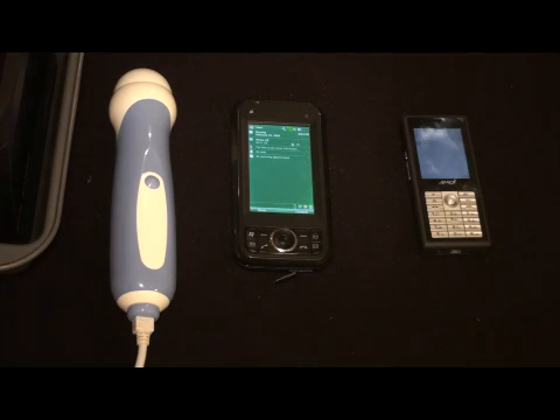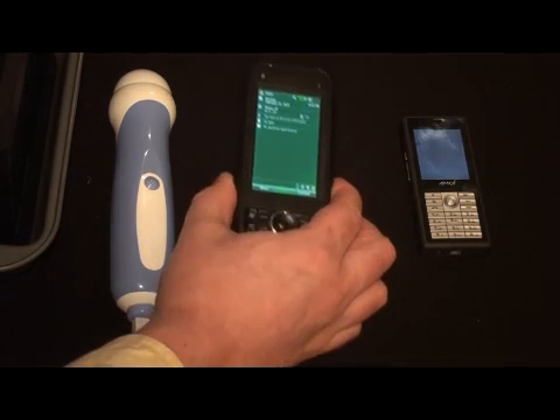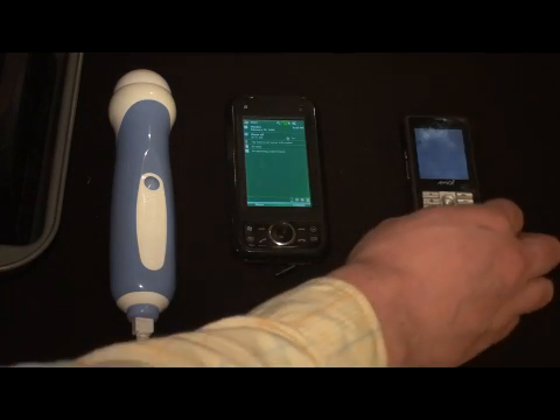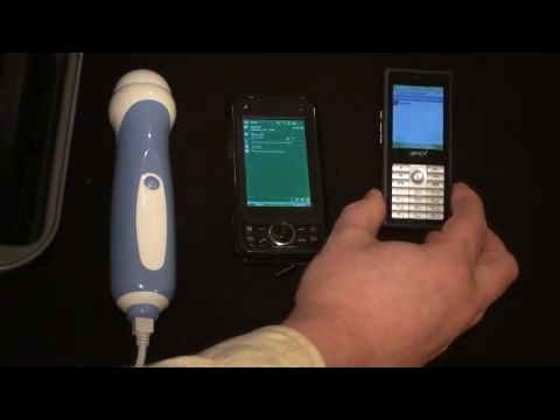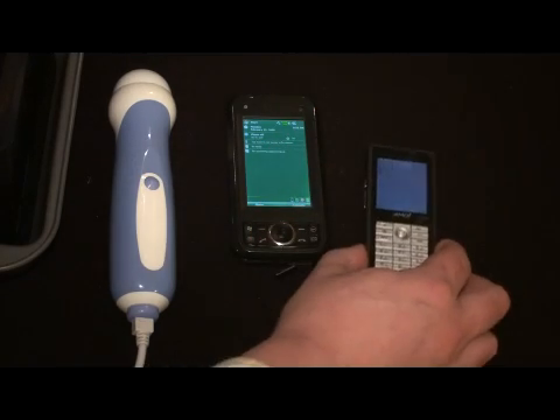I have two devices here today that I will show you. The first is a Toshiba G900. This is a relatively old model phone, but it is still available both new and secondhand. We also have an Amoy phone that's, as you can see, quite small. It's a very inexpensive phone.